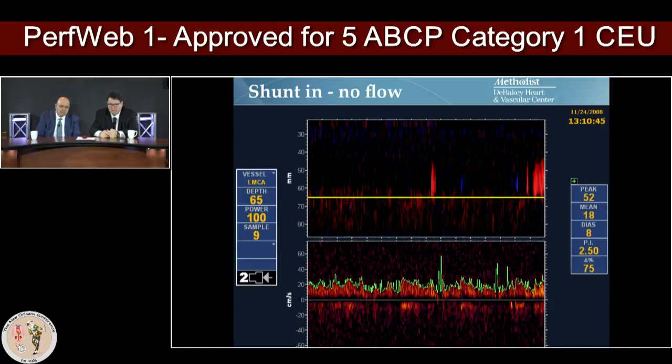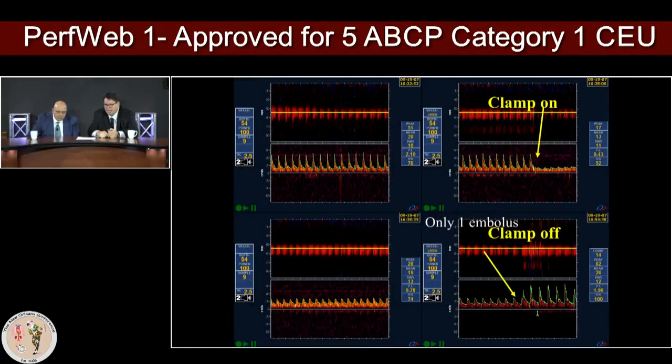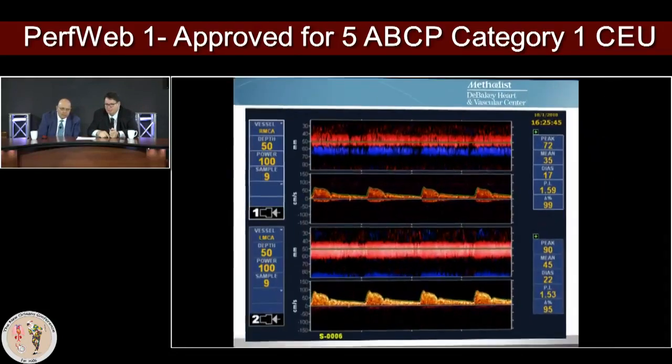I'm going to skip the carotid because I think we are not interested in the carotid surgery. This is just one picture that during the carotid, we use a shunt to bypass the surgical field. If your cannula or the shunt is not perfusing, you can see there's no flow in the brain. And this is just a simple clamp action: you put a clamp on, suddenly your flow is definitely decreasing. We can immediately see how the clamp placement and the releasing of the clamp are able to help us.